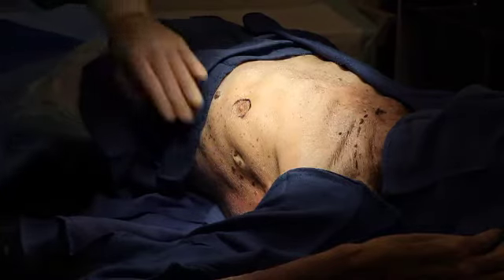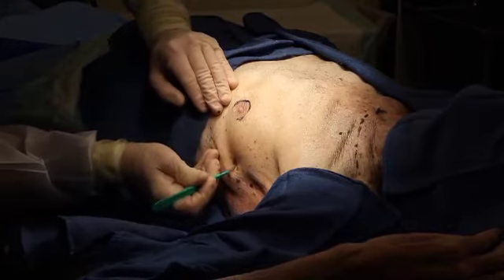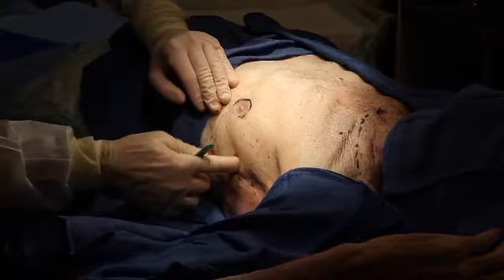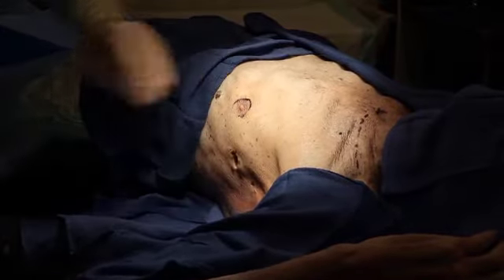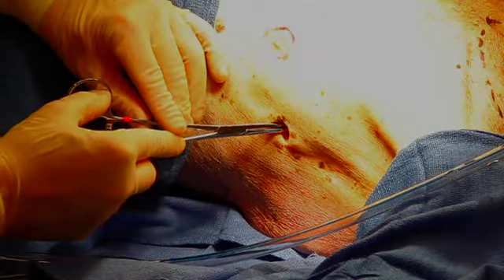Make a 2 to 3 centimeter transverse or horizontal incision with a scalpel at the insertion site and bluntly dissect through the subcutaneous tissues just over top of the rib. Using the tip of a large clamp, puncture the parietal pleura above the rib and enter the chest cavity.